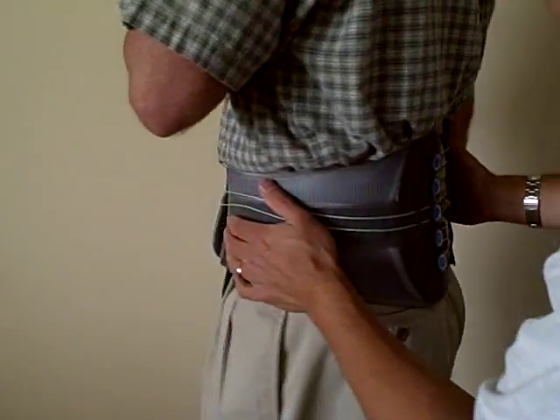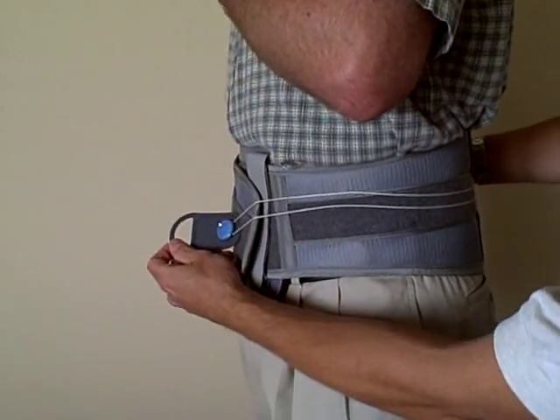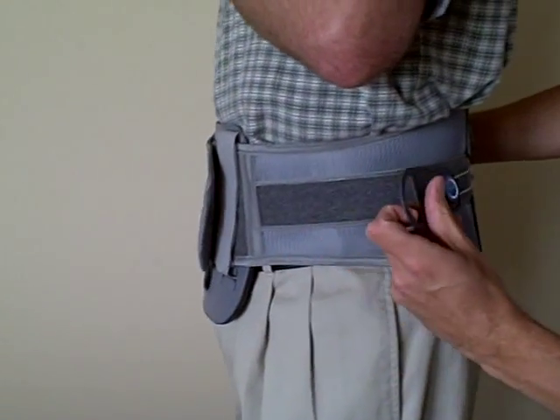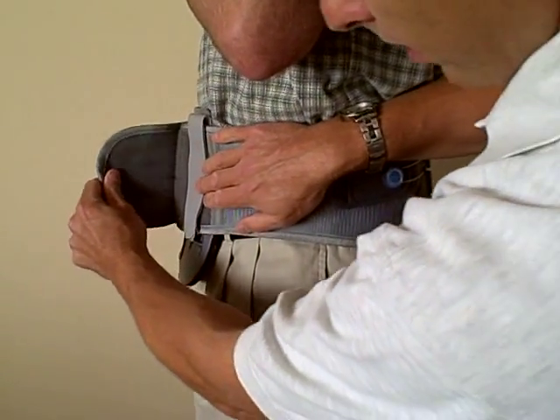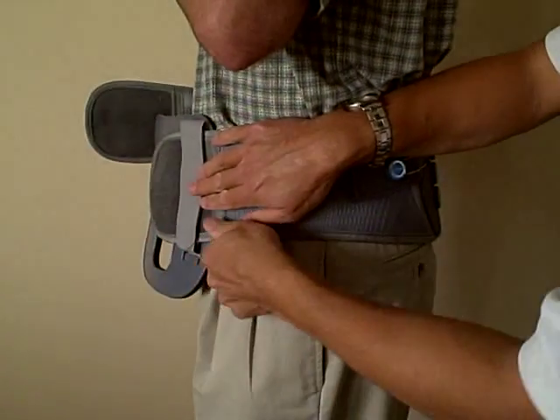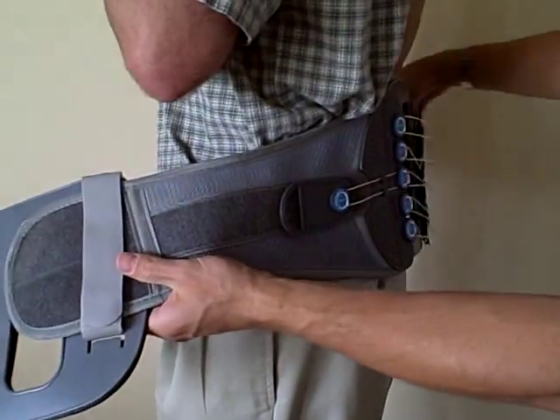When it's time to take the brace off, the patient will lift up on the handle, move it back, and simply take the Velcro off and remove the brace.